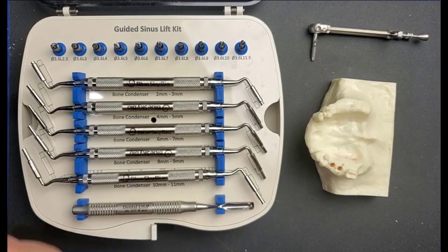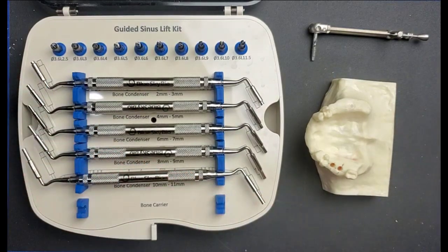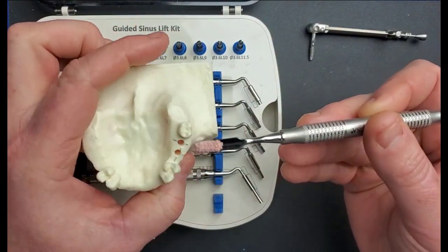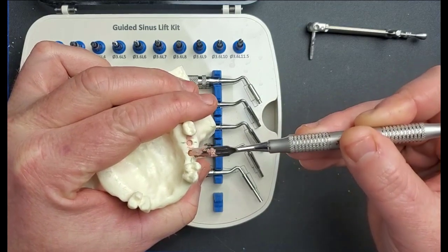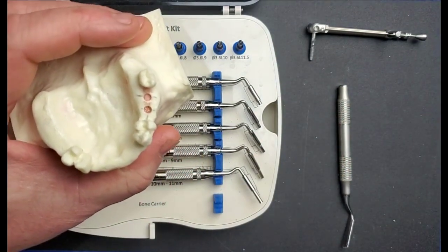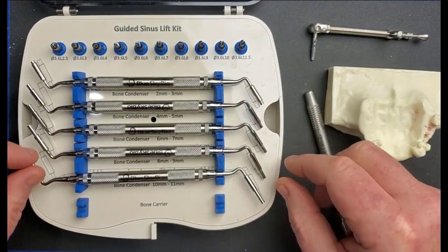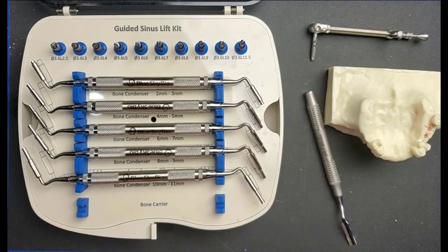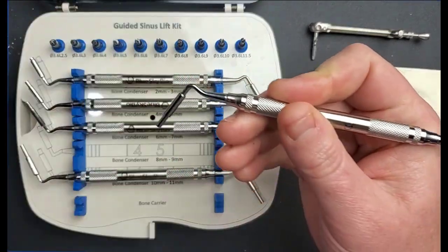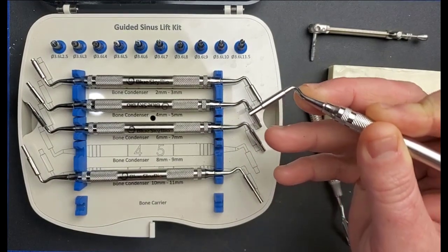With the sinus floor now patent, we'll grab the graft carrier instrument — this is just going to allow you to hold the graft material in proximity of the surgical site more easily. This is definitely something you would typically do two-handed with an assistant holding the graft. I'm going to carry it over and dump it into the sites. You don't want to completely fill the osteotomy up — if you do, you'll find difficulty condensing. You want to go about halfway up the sides of the osteotomy, then grab the condenser that corresponds to the depth you broke through at.